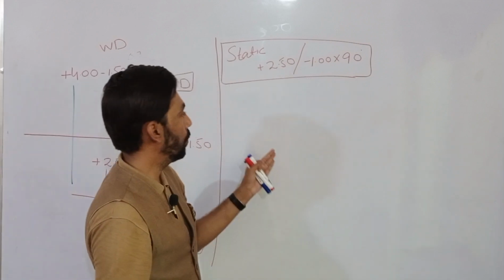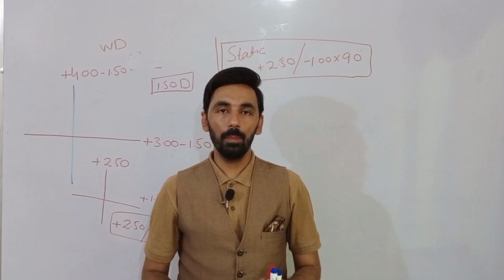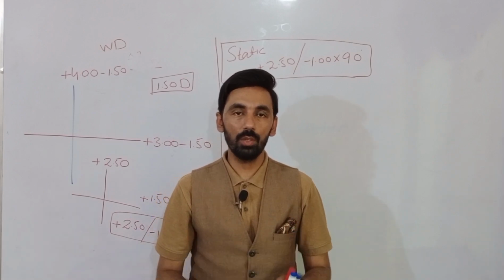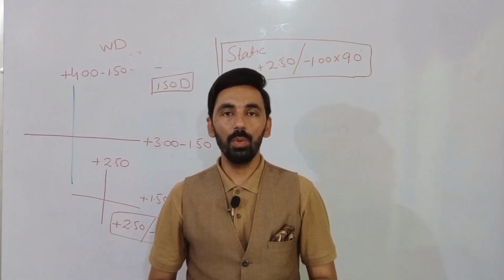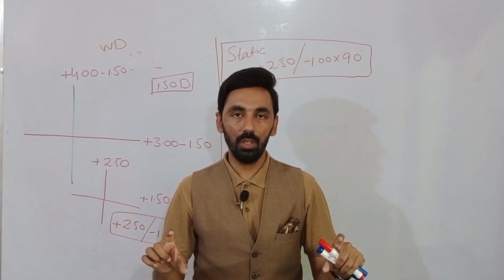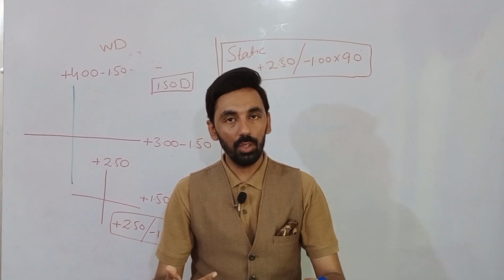So we are going to perform dynamic retinoscopy in an adult patient. The working distance is 40 centimeters. Suppose we are going to perform dynamic retinoscopy, Sheard's method, at 40 centimeters, right? And you know that actually the patient has a lag of accommodation.